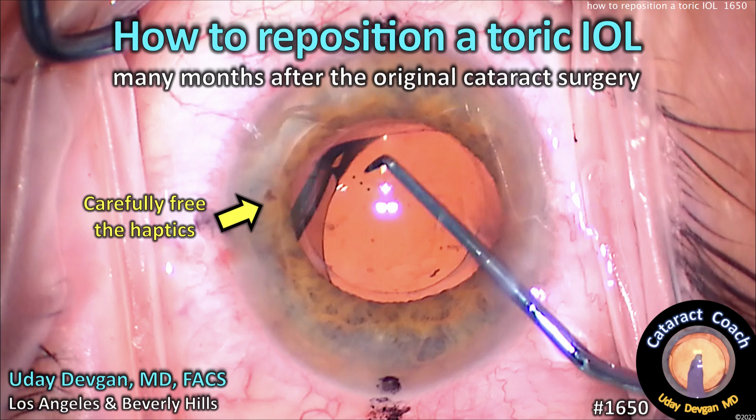CataractCoach.com. How to reposition a toric IOL well many months after the original cataract surgery.